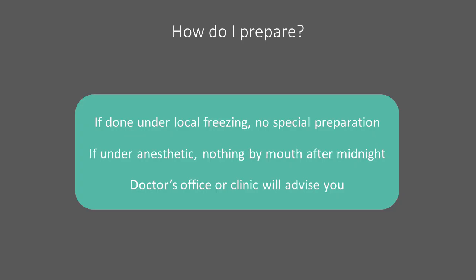Typically, there is no special preparation required if you are having a simple cystoscopy under local anesthesia, although your doctor's office or clinic may advise you of specific requests. For these procedures done under local anesthesia, it is probably best to eat a light breakfast or lunch prior to the procedure.